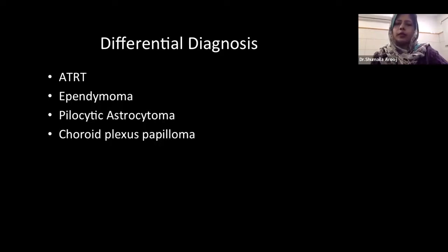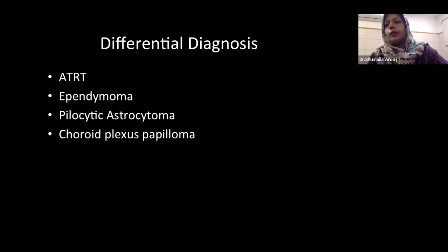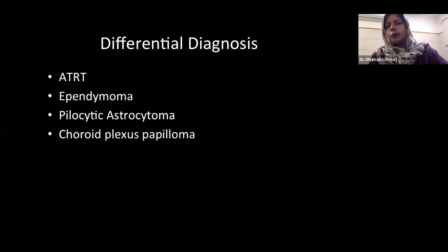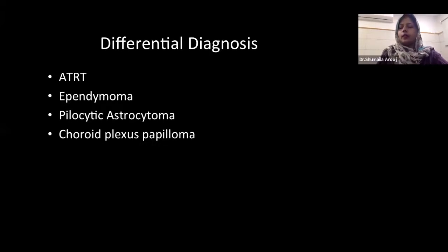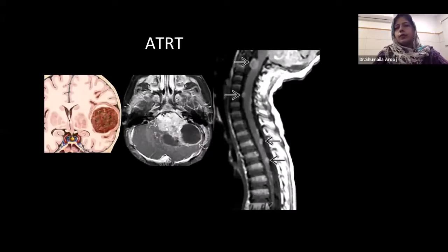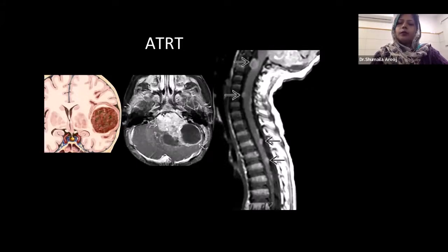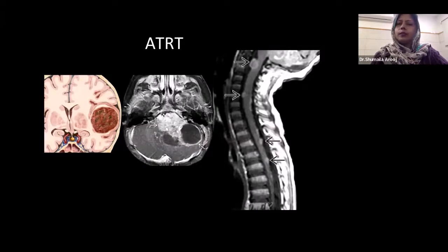When a case of medulloblastoma comes, the differentials include AT-RT — atypical rhabdoid teratoid tumors. Remember that AT-RT presents in a younger age group, under three years of age, and they are also very aggressive. Then you think about ependymoma, but for ependymoma you must image the entire neuroaxis and exclude certain syndromes. This was a case of AT-RT in a two-and-a-half-year-old child. We found a heterogeneous large mass with cystic component — these are huge masses with cystic components, bleeding inside them, solid enhancing component, in children under three years of age. In that case, you have to consider AT-RT.